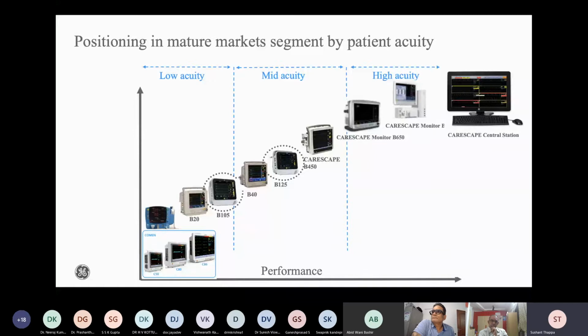And nowadays, because we are feeling more adventurous about healthcare, we also add a layer of artificial intelligence on top of it, which is the new buzzword in healthcare, right? So that's the overall idea. This is what monitoring today looks like. You start with a very basic monitor, which can just monitor SpO2 and NIBP, and then go all the way to very advanced parameters, 16 or 20 odd parameters at one point, including what gases are there, what analysis, ABGs, and all those things present within the monitors. So that's just a quick overview of how we label different monitors across care areas.